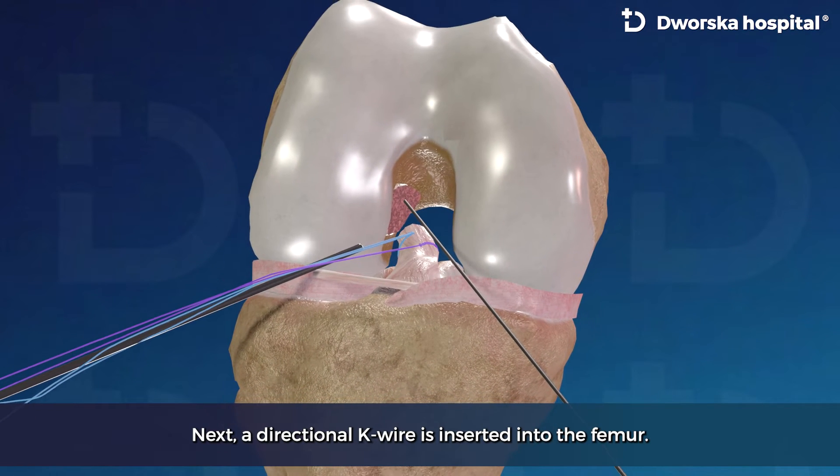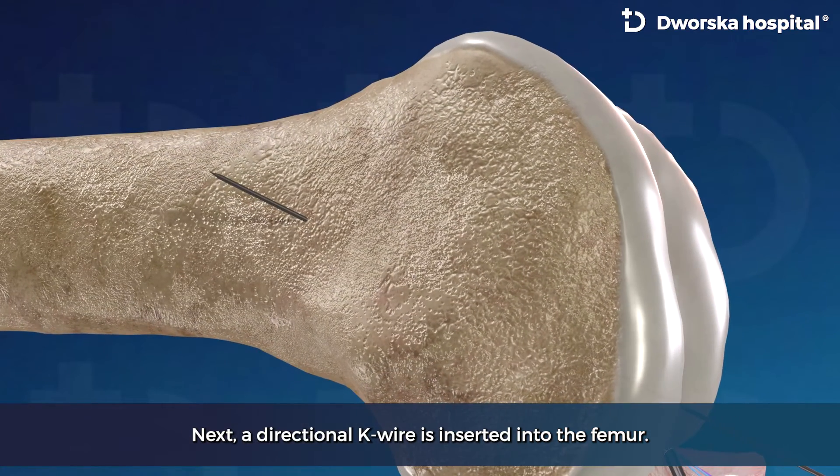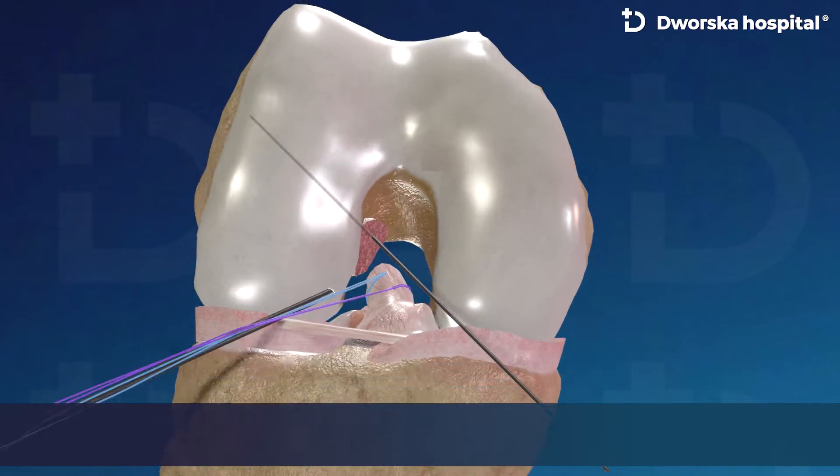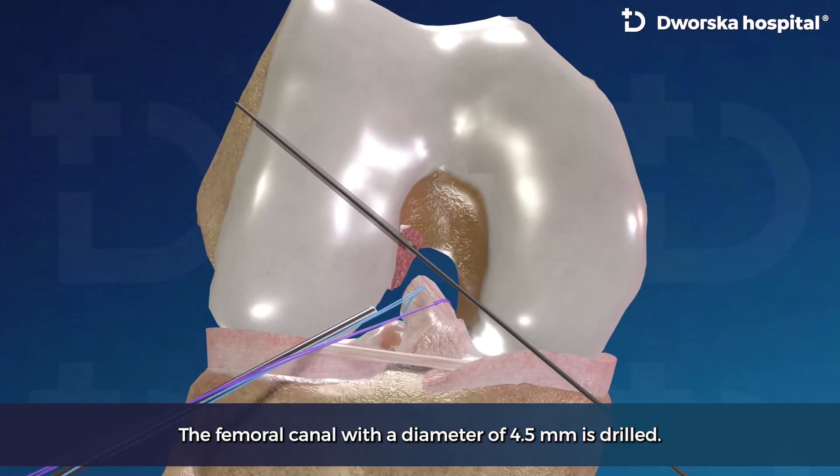Next, a directional key wire is inserted into the femur. The femoral canal with a diameter of 4.5 mm is drilled.